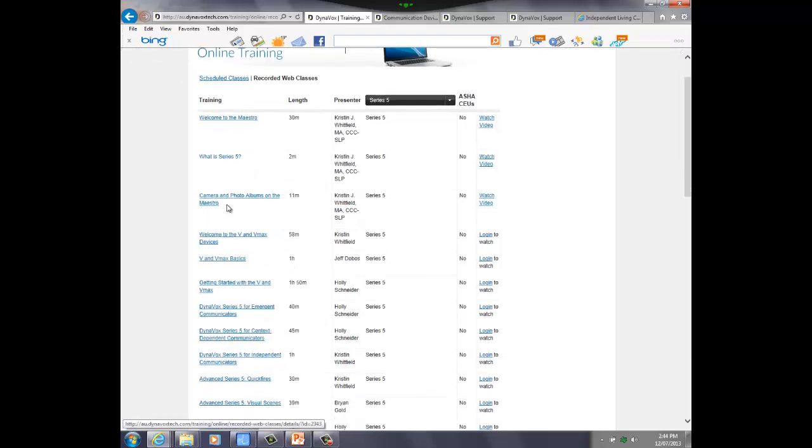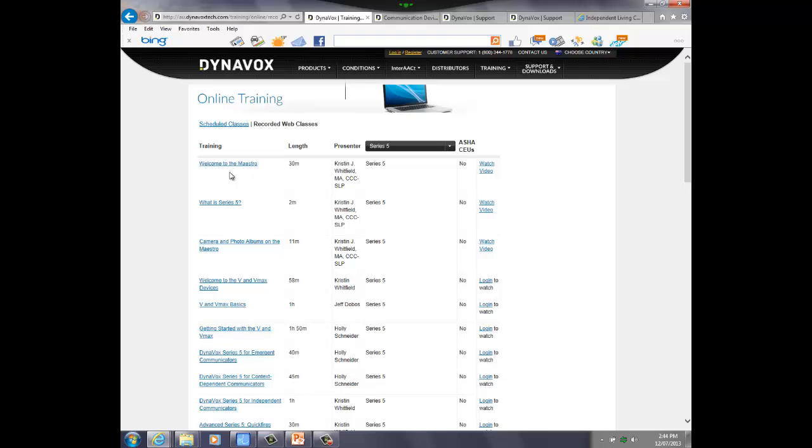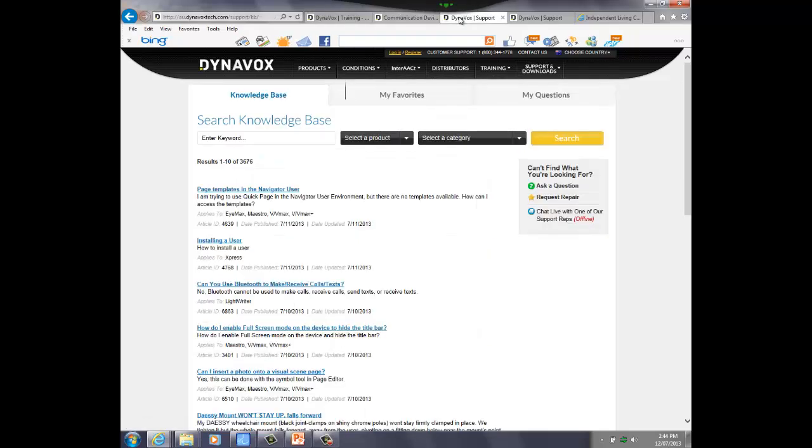What is the Series 5 software, if you'd like to know more about using the camera, and so on. So there's a number of different support online training materials available for you. It's also useful, you can go here to what's called supports and downloads. If you head to the download center, you can download manuals and other support material to help you learn about the device.